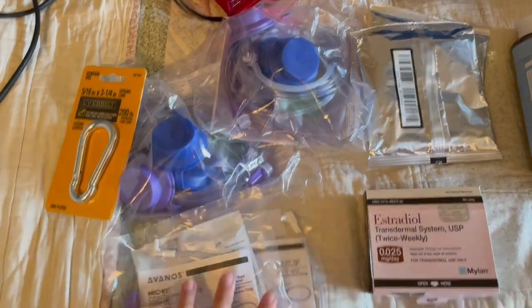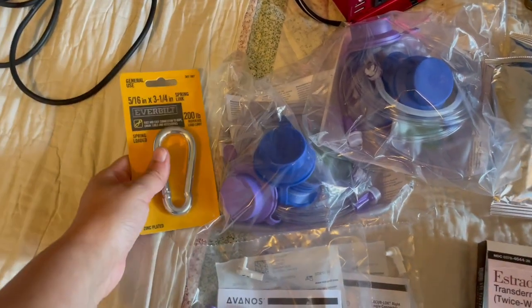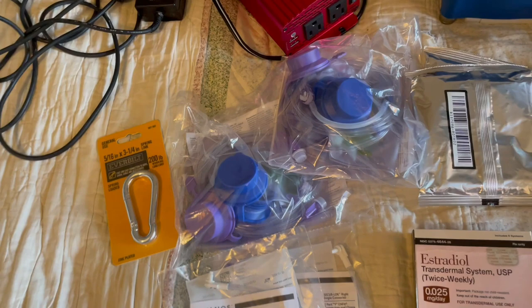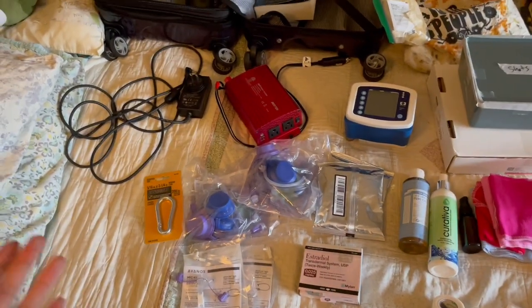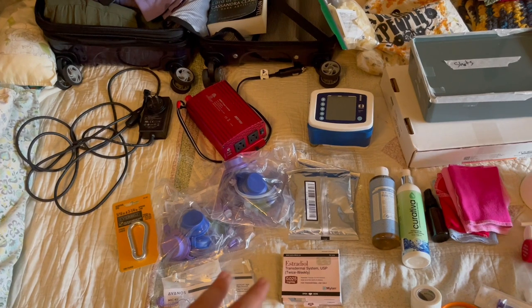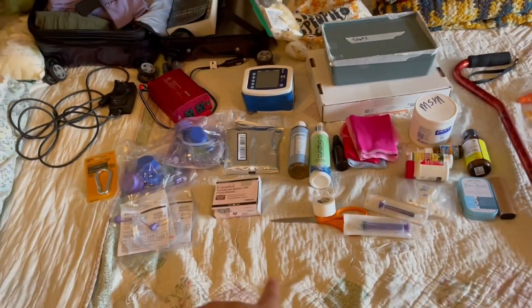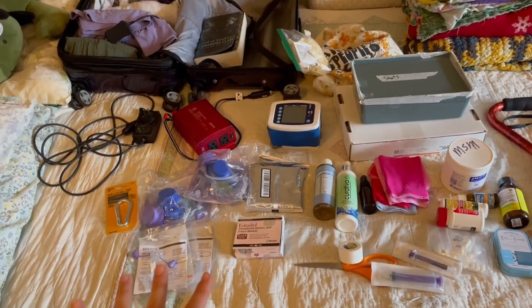Then I have my feeding tube bags right here, and a few extra extensions to bring in case I need to change that. I bring a carabiner clip to hang these up on the inside of the tent, and that has worked with my tent personally. But I would definitely check that out with your tent depending on how much water or fluids you're bringing and how much weight is going to be on the tent — definitely check that out before you plan on it, because that would be unfortunate if your tent wasn't strong enough to hold it up.